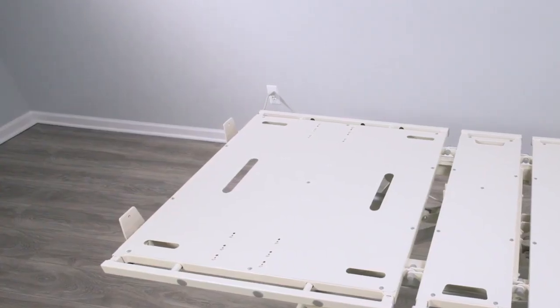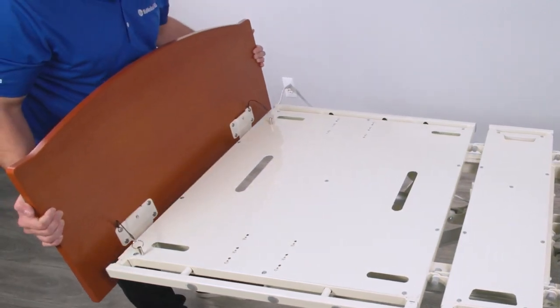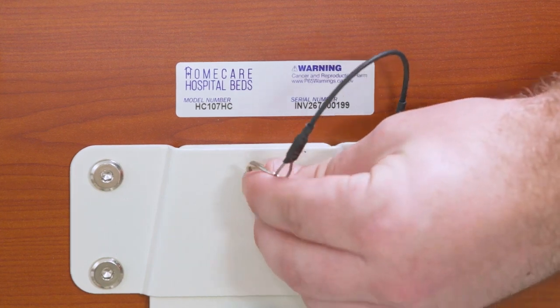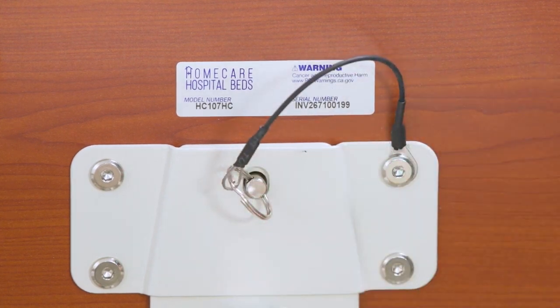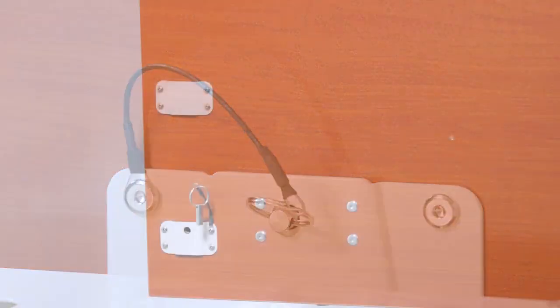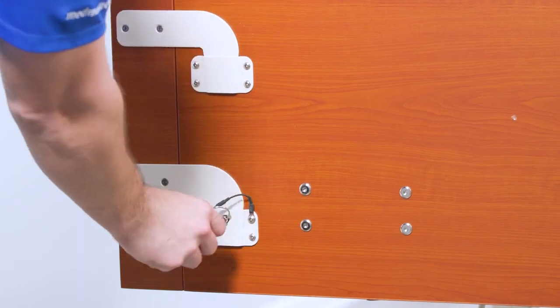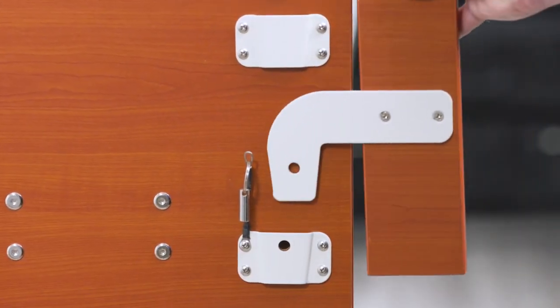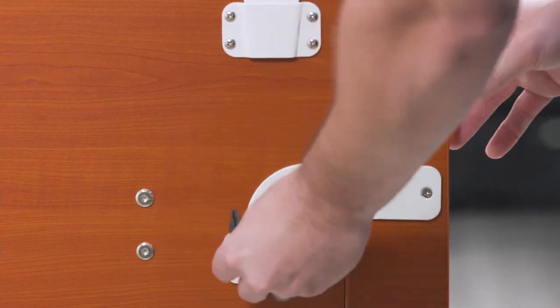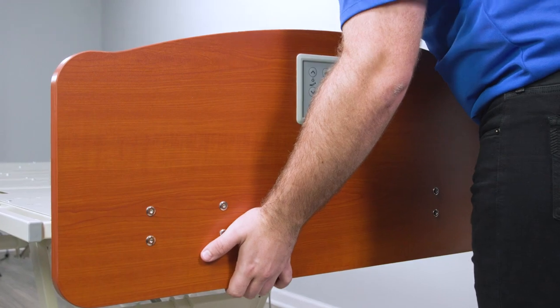Headboard and footboard. With the mounting plates on the headboard facing the bed, slide the mounting plate groove onto the headboard mounting bracket's vertical support. Insert the locking pin through the mounting plate into the headboard to secure the headboard in place. Repeat on the other mounting plate. Attach decorative headboard end pieces by sliding the ends into the external headboard vertical support brackets and lock with pin. Repeat the same procedure for footboard installation.